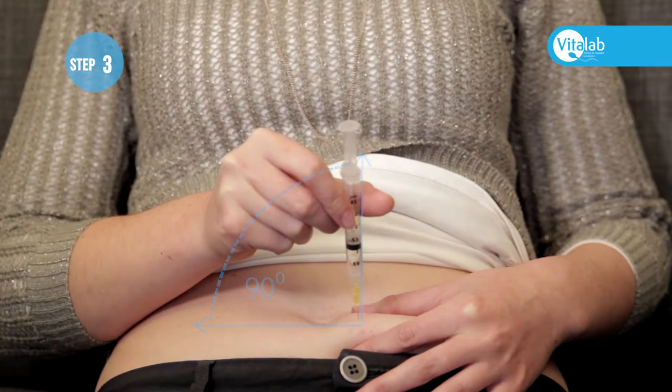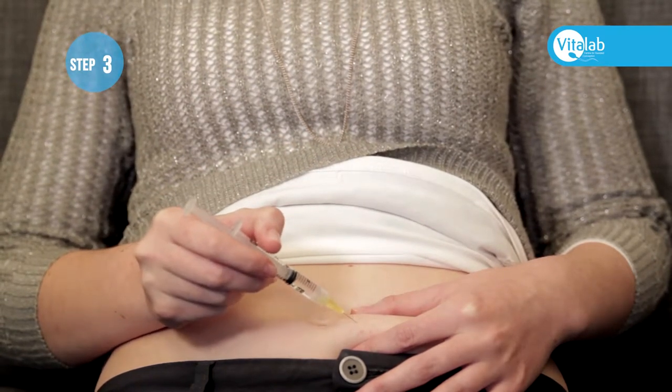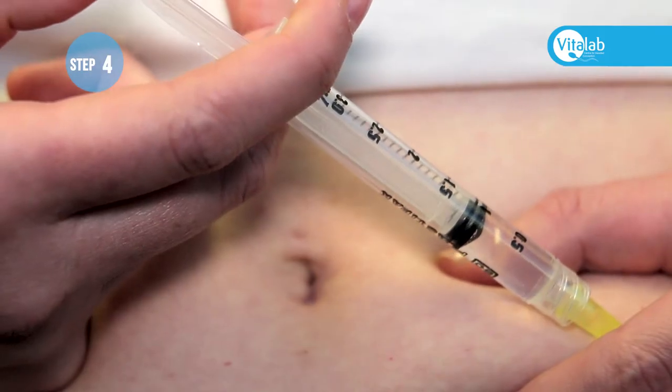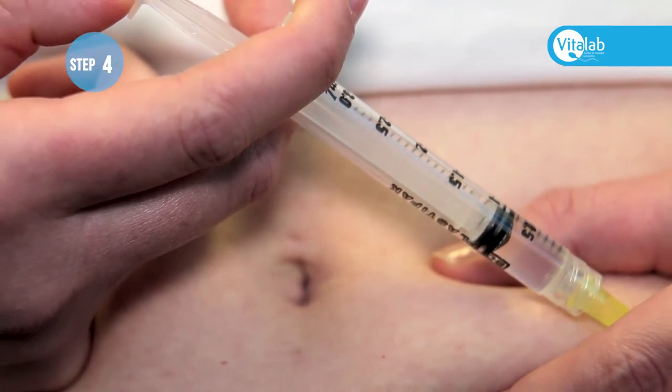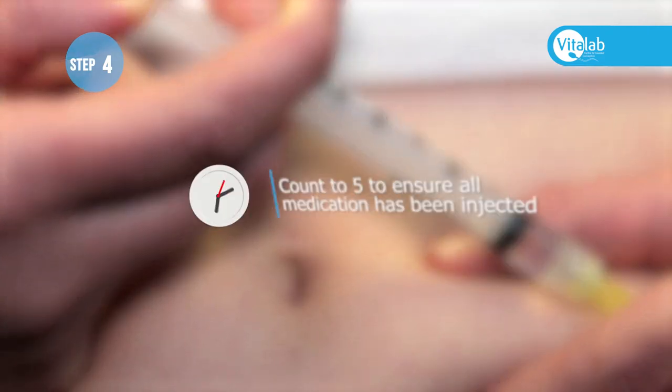The 90 degree angle reduces post-injection bruising, especially with Clexane. Inject the medication, ensuring that the plunger of the syringe goes all the way in and all the medication is administered. Do not pull the needle out immediately — you can count to five to ensure all the medication has been injected.